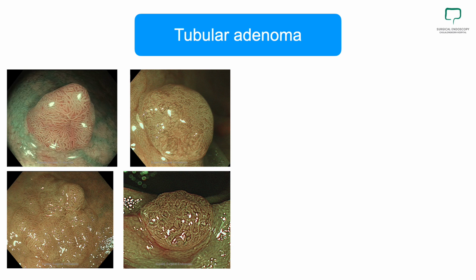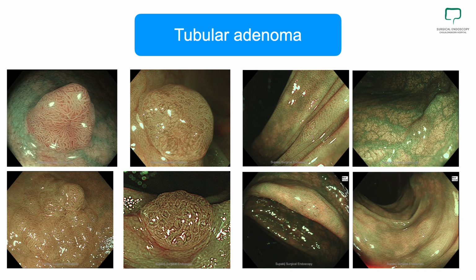cancer. These are tubular adenomas, which were confirmed by NBI using the characteristics of superficial vasculature and surface structure. All of them should be removed when we find them during colonoscopy. With current colonoscopy technology, we can find this small adenoma, as I showed you on the right side, and cut it out to prevent cancer. In some institutions, they do not cut small adenomas and choose surveillance after a small adenoma is detected. But in my endoscopy center, I prefer to cut off any adenoma I find, because our patients may not come back for surveillance and it might cause problems later.